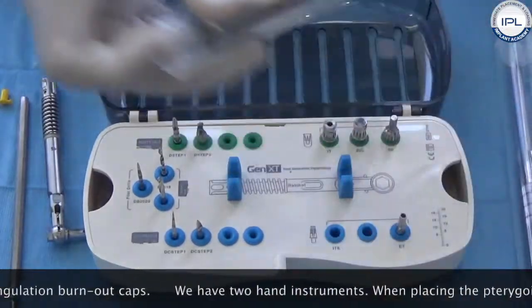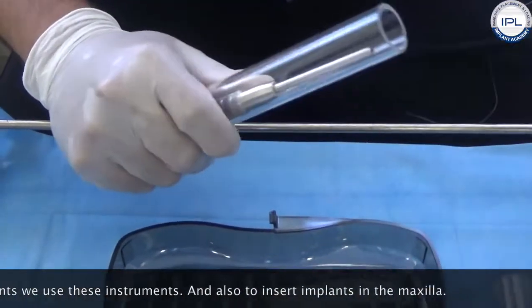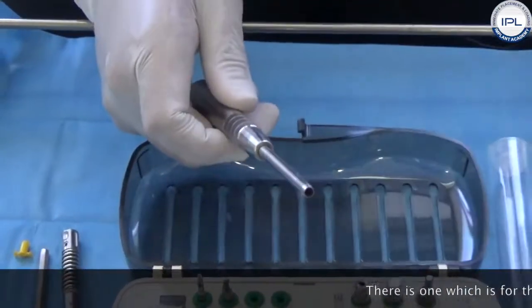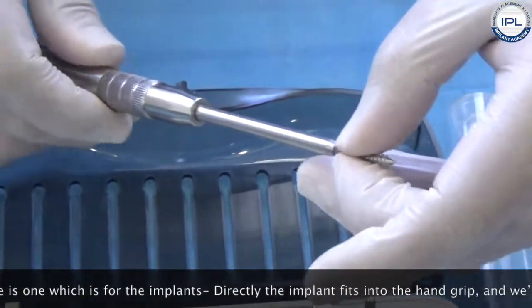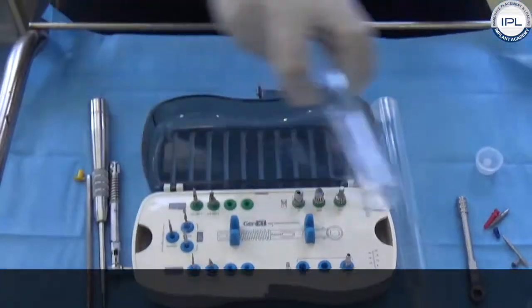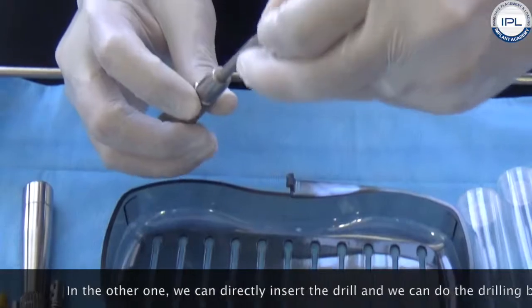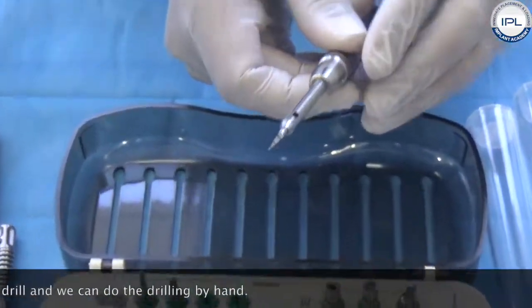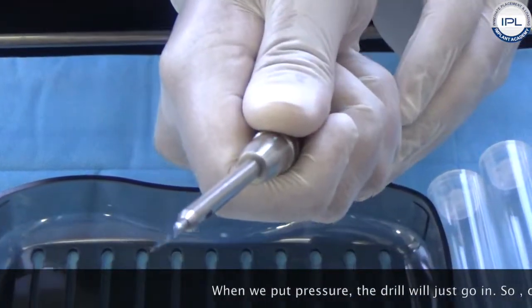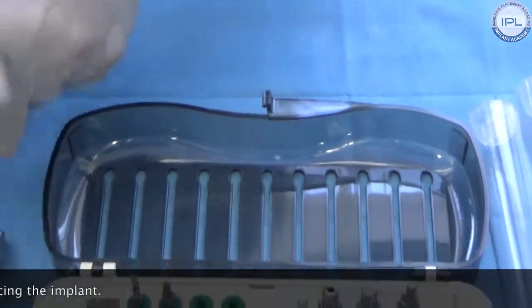We have two hand instruments for placing pterygoid implants, also useful for inserting implants in the maxilla. One instrument accepts the implant directly into the hand grip, allowing you to angle it into the pterygoid and screw in the implant. The other accepts the drill for hand drilling. The bone in the tuberosity is very soft, so with light pressure the drill will just go in. One instrument is used for drilling and the other for pressing the implant.